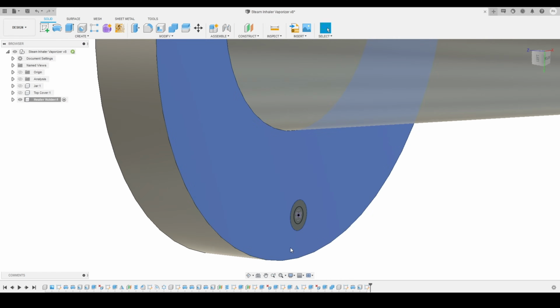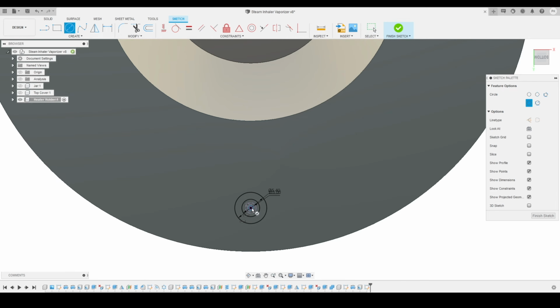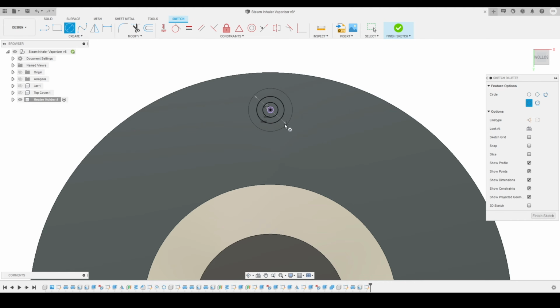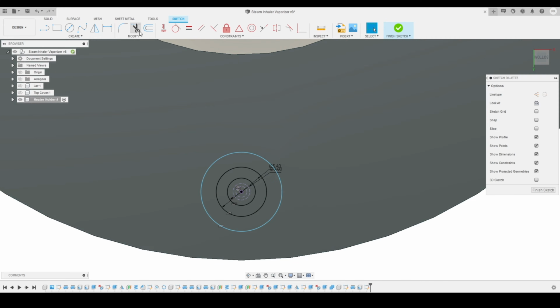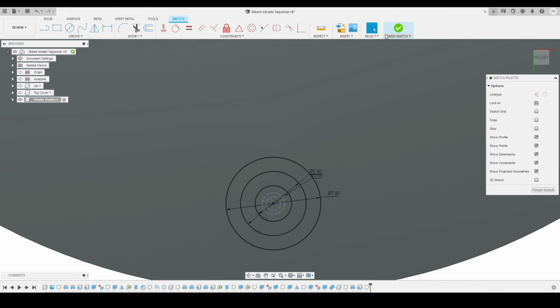Here you can see, I will create one more circle, a big circle like this on both the points. I will create one more circle over here also, and now I will select both the circles and apply the equal constraint. Now I will define the diameter of this circle. So this one I just want to keep 7.8 millimeters. Here you can see, and we'll press finish sketch now because we are done with this.